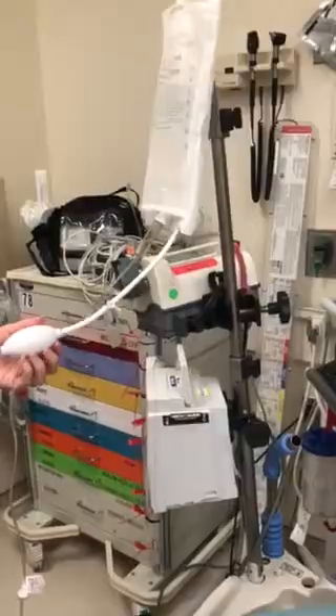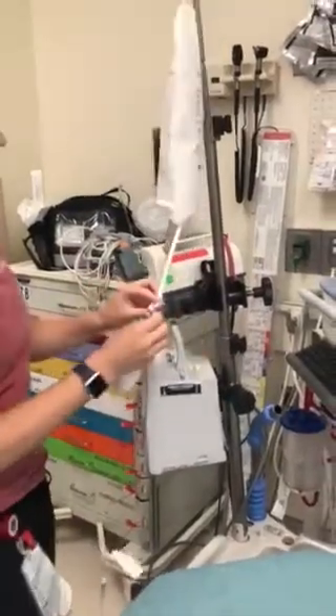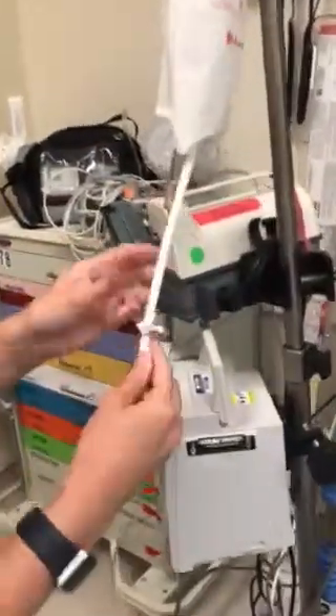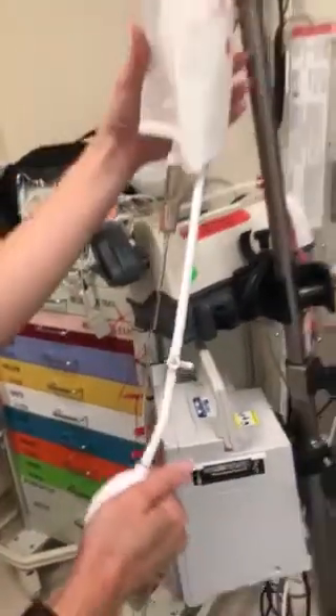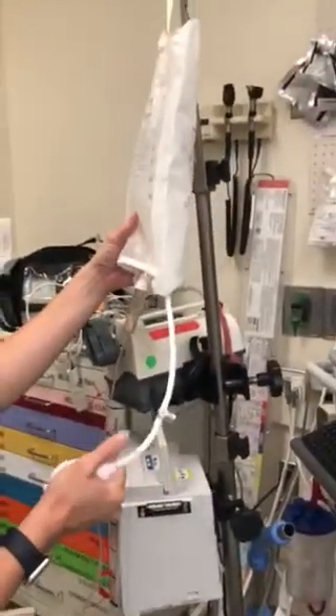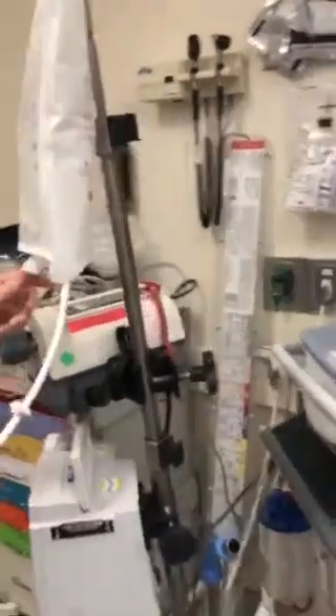At this point you can hook it up to the patient and unclamp it if you want. Make sure that the valve is off to the side so the air doesn't get out. Then go ahead and squeeze your pressure bag until it inflates.